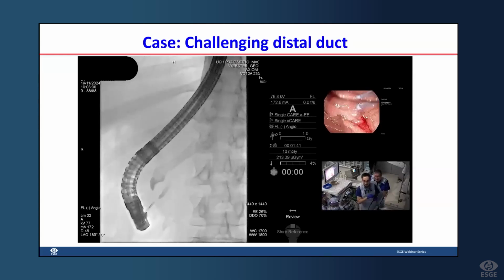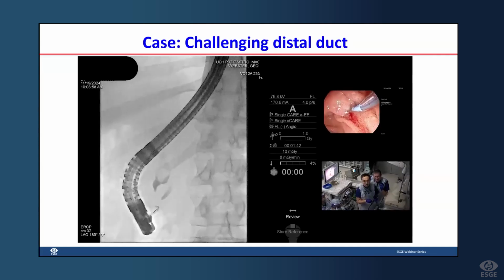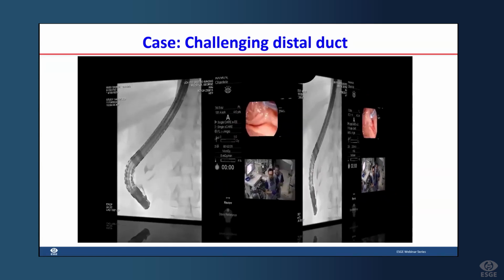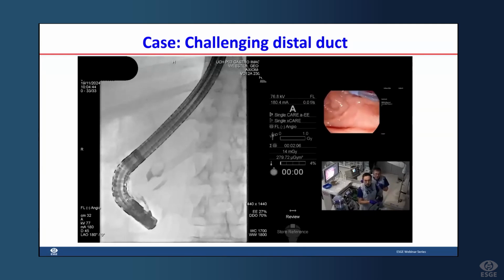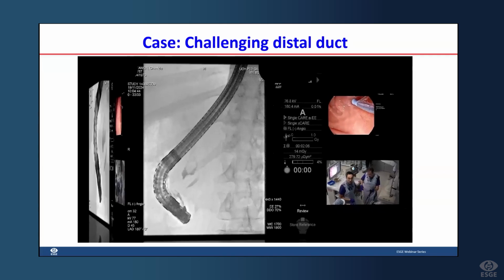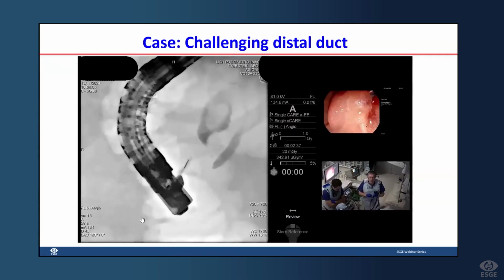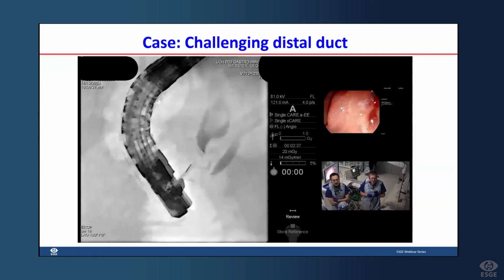You can just try and go with your wire. It might flick here. Screen. No. No. Okay. So this is a very good example where having a bit of contrast really helps you to define the anatomy. Do you mind if I just have a little wiggle here, Heng? Because this can be very, very tricky. Right. So let's just put a little bit of contrast in there. Screen, please, and inject there.